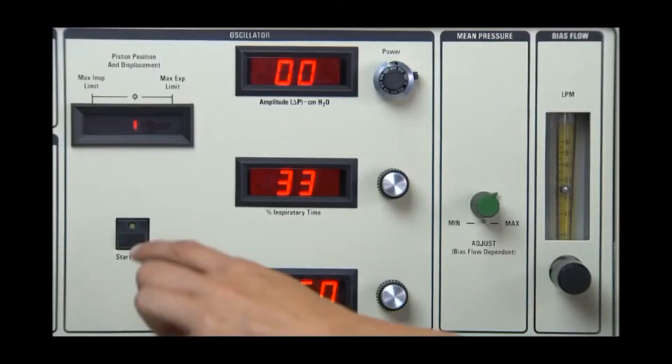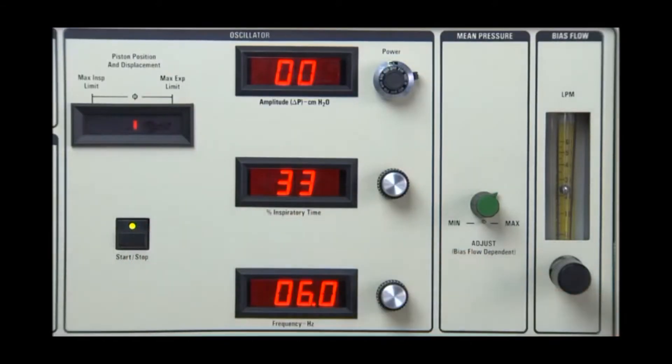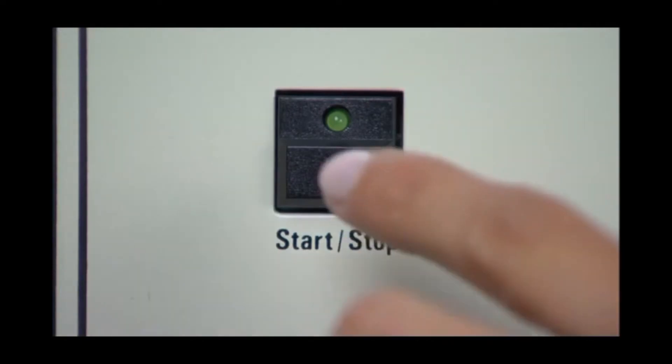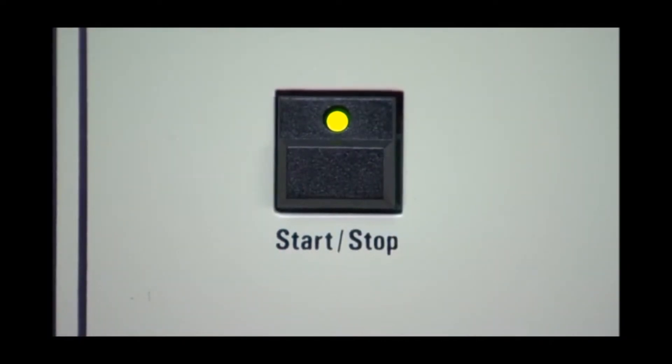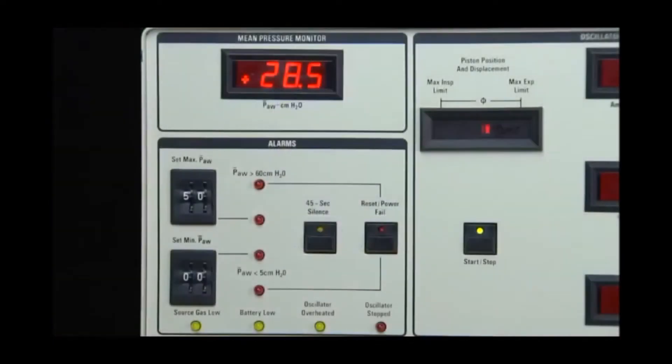To activate the oscillator, press the start-stop button. The green LED will illuminate, showing the oscillator circuit is energized. The mean airway pressure must be at least 5 cm of water pressure in order for the oscillator to activate. The oscillator may be stopped without complete loss of mean airway pressure. This allows for auscultation of the patient without the loss of lung volume.